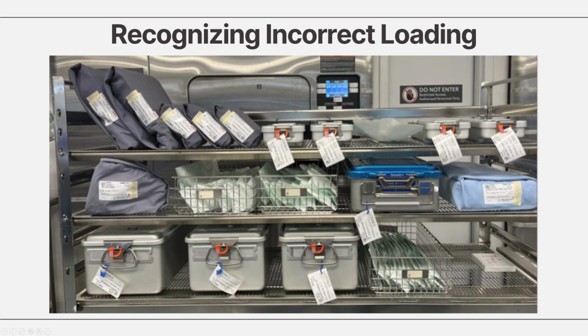And even this one, we have a metal tray. Even if it is lighter than this linen bundle here, you should never place metal above any linens. So it would be best to maybe put these here in the bottom and carry this on top. So it's really important to shift things around here.